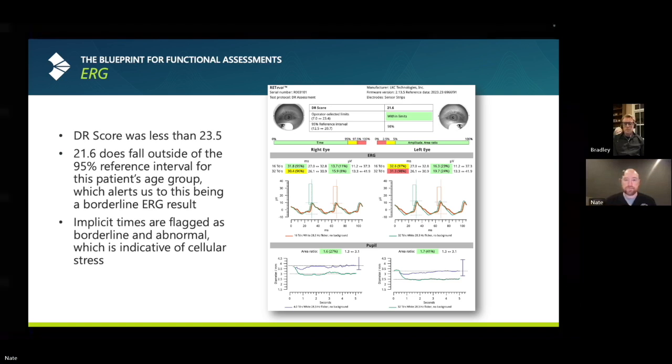So kind of a related question. It says, what quality of change is considered progression? It depends. You're going to add up the entire picture of what the retina looks like. What's the OCT? What's the A1C? What's the vision? When I see those percentages change by 10 to 15%, that's what I consider to be clinically significant. If it goes from 52 to 56, or 52 to 49, that can be intertest variability. When it changes by 10 to 15% or more, 10% is my minimum, that's what I consider clinically significant for these percentages here.